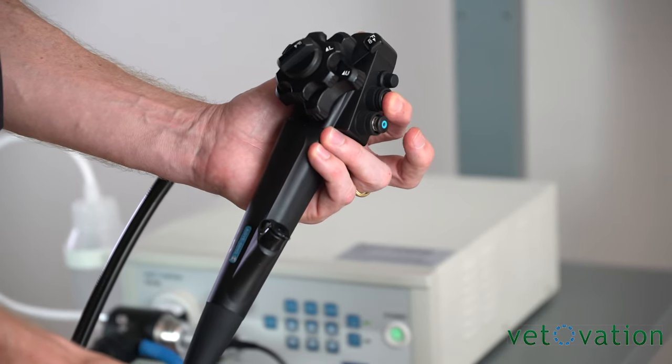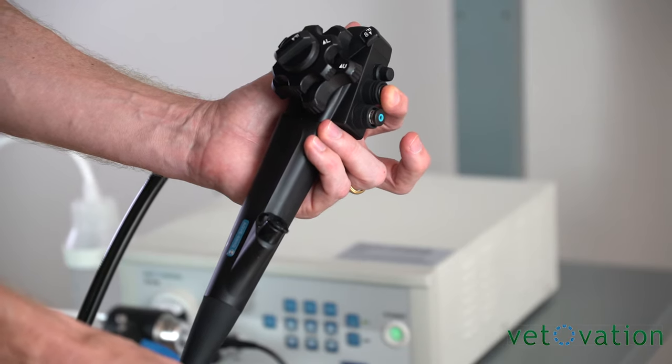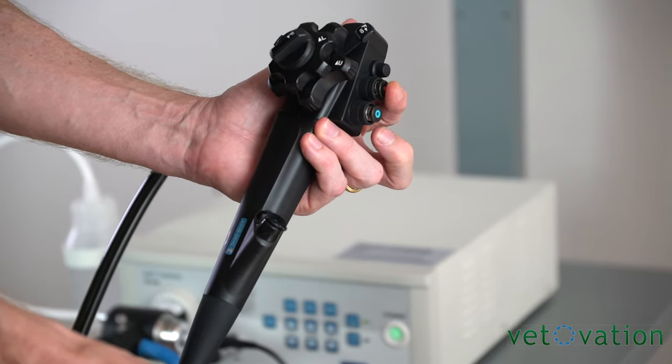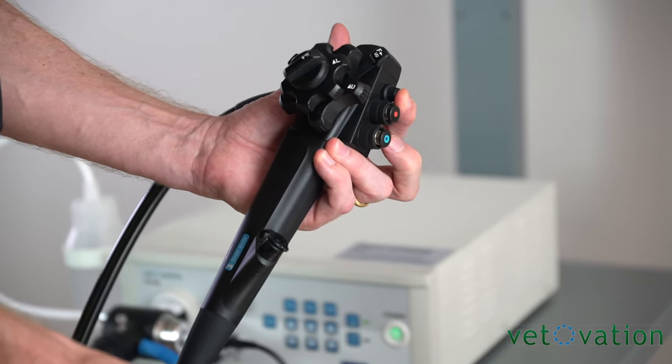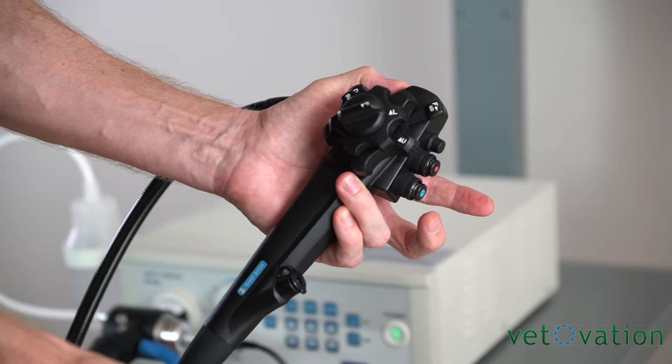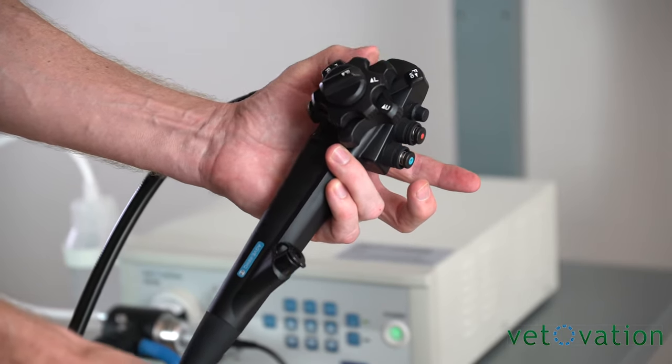The red button evacuates any air that's in the stomach at the end of the procedure or will also suck out any fluid. The button above the red button takes a still shot image. The button that's on your thumb turns video on or video off during the procedure.